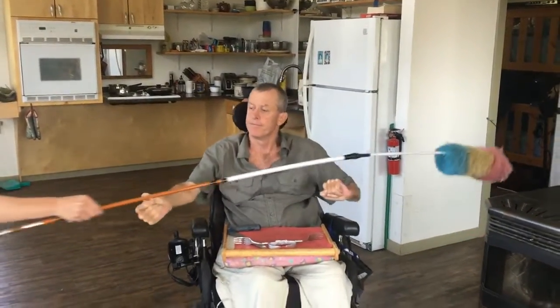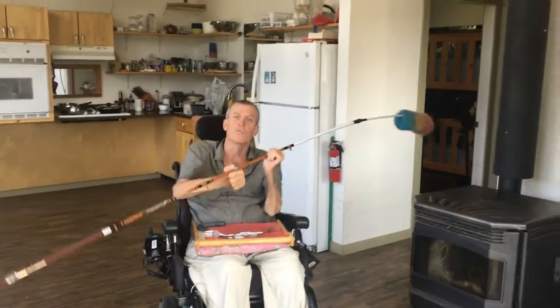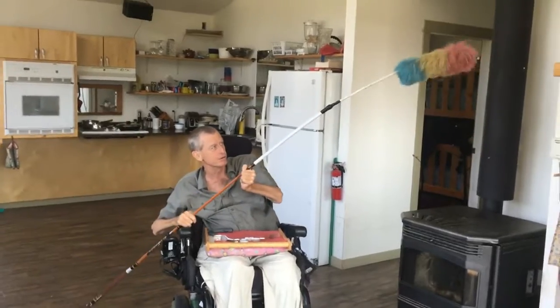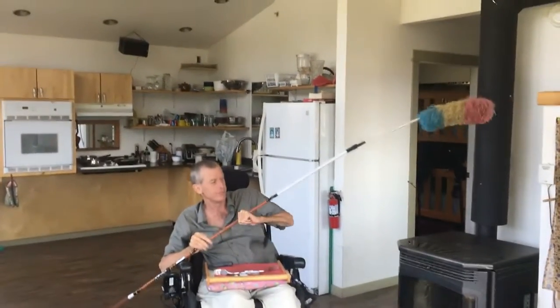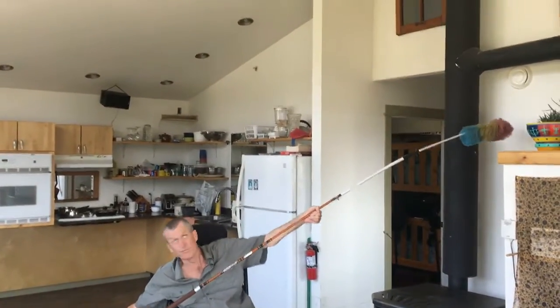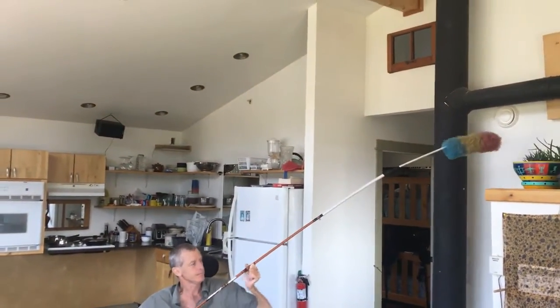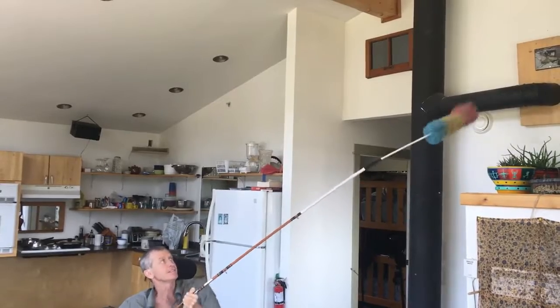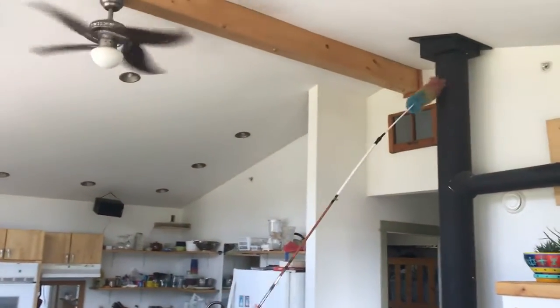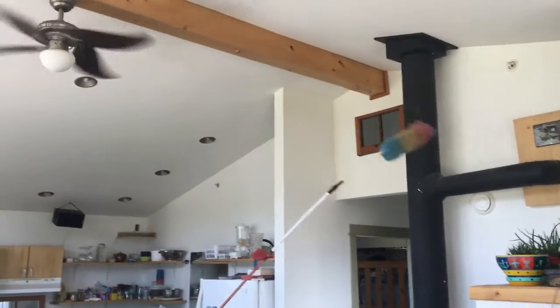Yeah. And say you want to go super extendo and you like dusting. I just stuck the little dollar store duster on this one. Just jammed on there perfectly. And my ceilings are 10 or 11 feet high. But with this, I can get right on up there and dust, and it works really good. Just don't hit the ceiling fan.